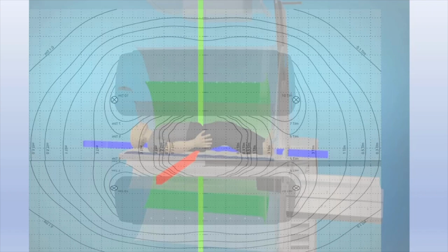So in this case, this MRI machine has a maximum spatial gradient of 10 Tesla per meter. So here's 7 Tesla per meter, 5 Tesla per meter. So if you flip it again, you could see these different values on the other side, and it's all a mirrored image.